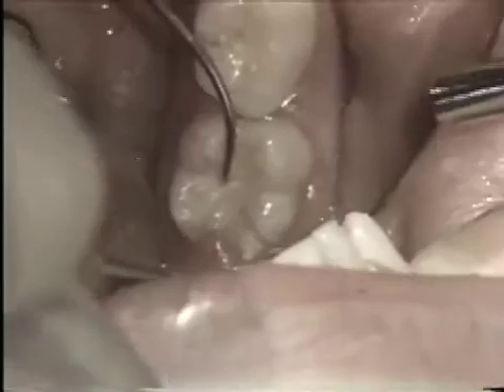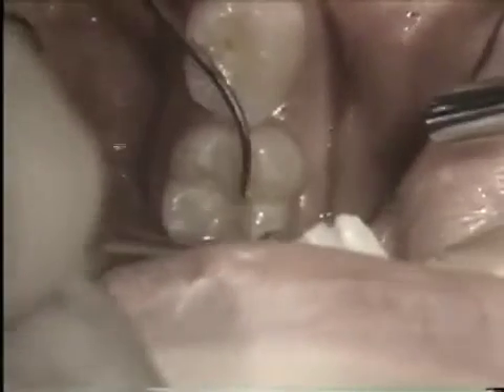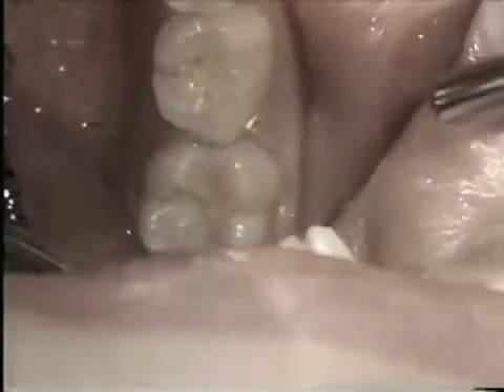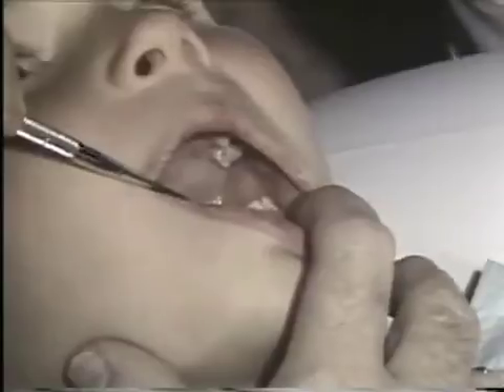We check all the pits and fissures and see no soft penetrating areas that represent decay — only a little debris accumulated on the surface, which we'll clean out. We have a tooth that can benefit from sealant treatment, and one we'll demonstrate the technique on.